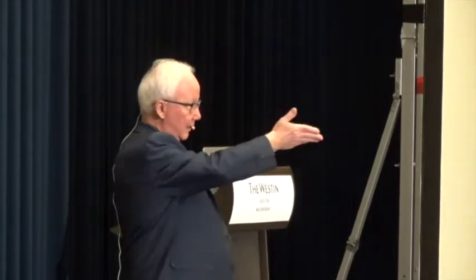So look at your colleagues, ask them about it. I'd have two or three of the vendors in to say, show me what you got. I'd go to an actual commercial dental meeting, like if you're ready to buy now, maybe the Greater New York, because that's all about vendors, and go see it in action. Pick up the mouse. See if you can make it do what it's supposed to do in the software, rather than depend on them saying, oh, look at what we got over here, and they show you their best example. I can show you thousands of images that are crappy.